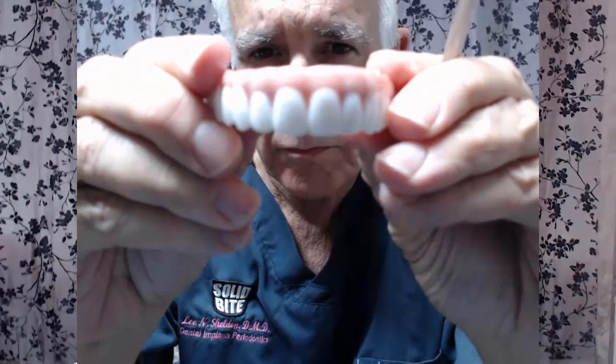Let's take this prosthesis off so you can see it a little better. This is a solid piece of ceramic. In the laboratory, this solid piece of ceramic starts as a block, and then little saws gradually sculpt it so that you have gums and teeth. In the laboratory, the teeth and gums are colored so that you have a natural appearance.